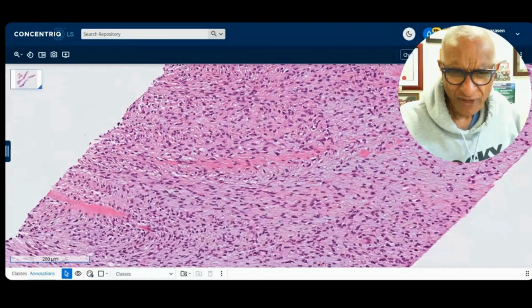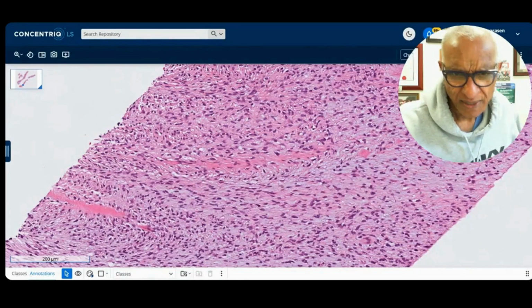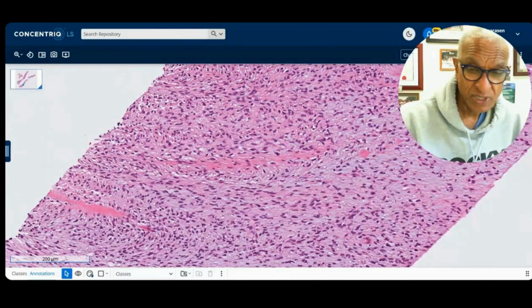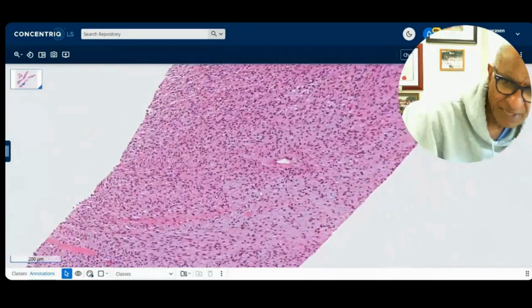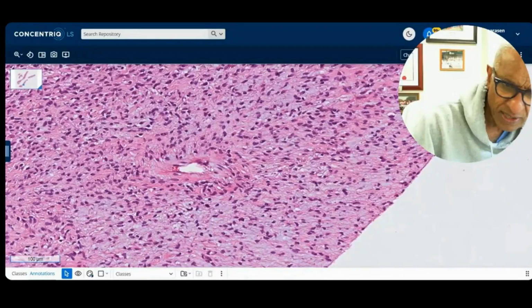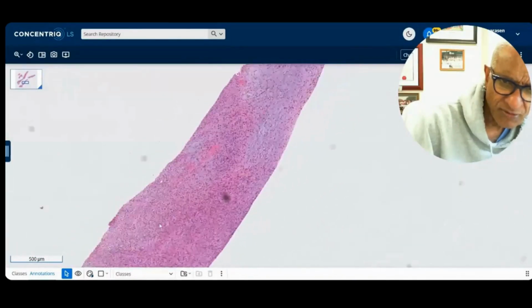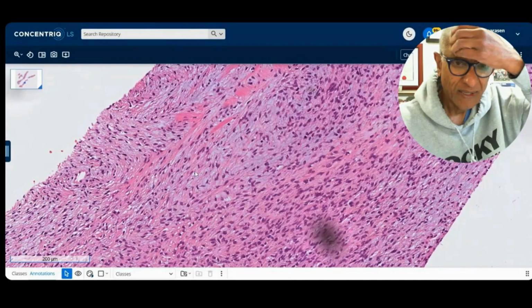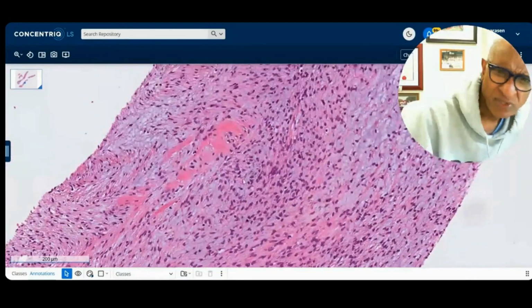The reason he found these was that he was getting referrals or consults of metastasis in the lung, which looked very bland, very myxoid, and very hypocellular. When he looked at the primary tumors and put the two together, he called them low-grade fibromyxoid sarcoma. Remember, then there was no MUC4, no fusion genes, and no FISH to help you. But these arcades were described. The other aspect described was periarteriolar sclerosis, so a smaller vessel with sclerosis around it. So it does have some good morphological features. Like I was pointing out here, there is very focal hyalinizing sclerosis, but I typically don't associate hyalinizing sclerosis with low-grade fibromyxoid sarcoma. That's why I didn't want to use that term.